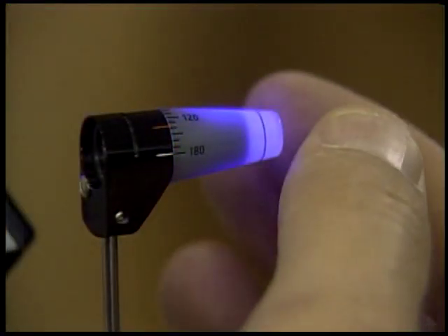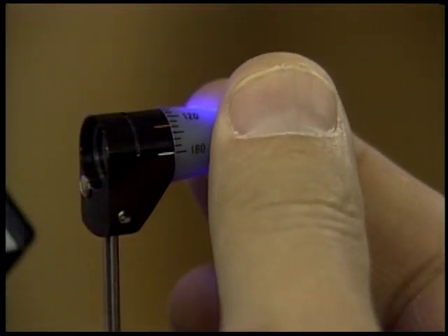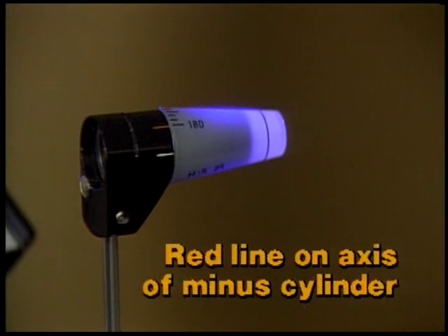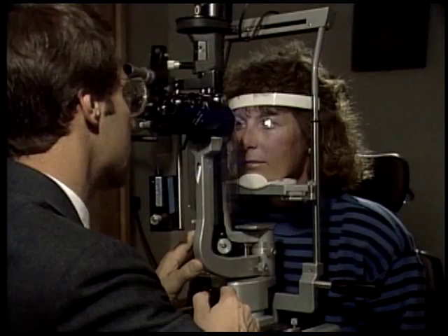Astigmatism due to abnormalities in corneal curvature of greater than 3 diopters may influence the reading by producing an elliptical area of corneal contact. This can be minimized by adjusting the axis of the biprism. Convert the patient's refraction from plus to minus cylinder. Then set the red line on the prism holder to minus cylinder on the prism scale.